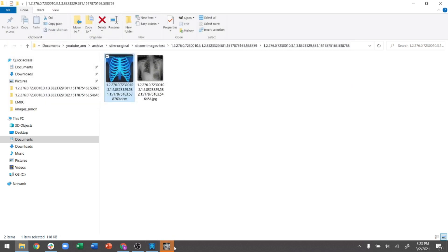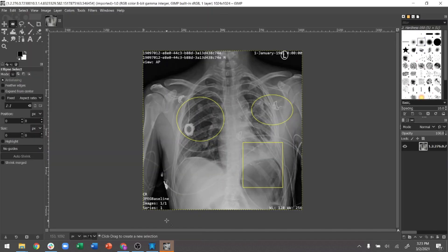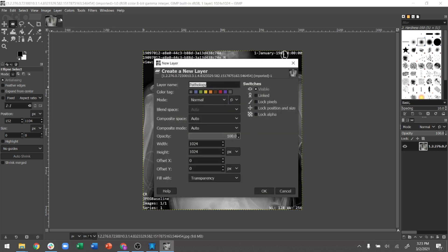For my current version, I first convert from DICOM to JPEG, and then from the JPEG I create label maps. This is essentially what the specialist has annotated for us, and our intention is to create a labeled image map from it. In GIMP, I first create a new layer — in this case I'm calling this layer 'pathology.'